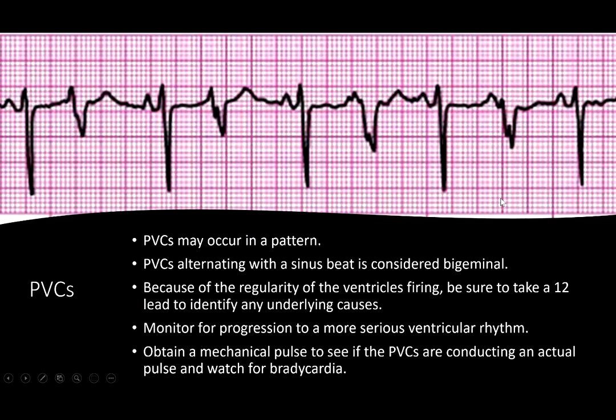So my worry with this is that PVC conducting a pulse? Now for testing purposes, when you're doing rates, we'll always assume that the PVC is conducting a pulse with this rhythm. So if you had this as say a 6-second strip, and again, I don't know how many seconds it actually is, but just hypothetically, if this up here was a 6-second strip, I would count my rhythm 1, 2, 3, 4, 5, 6, 7, 8, 9. I would consider that 90 beats per minute on a test.